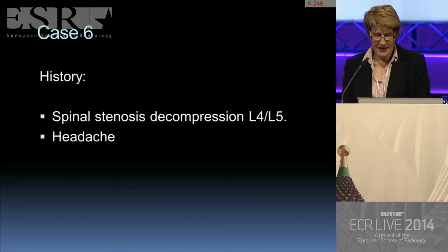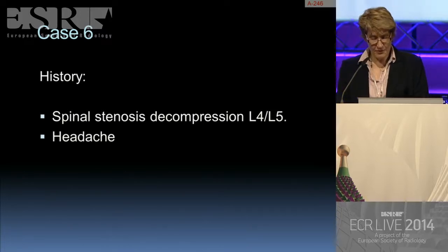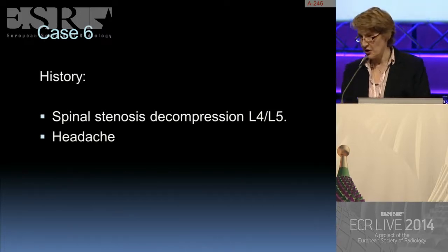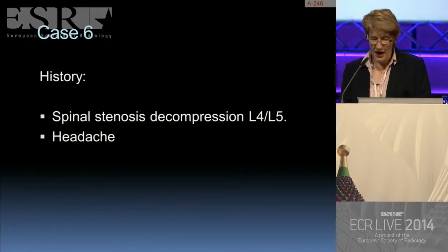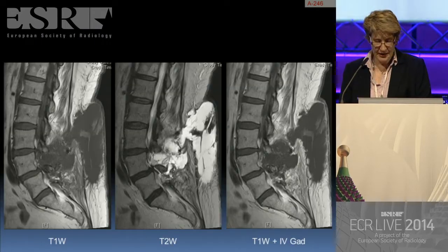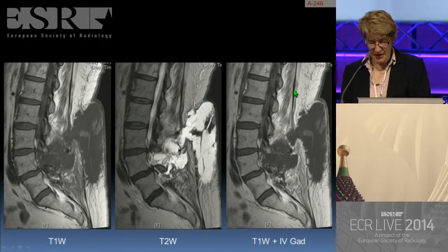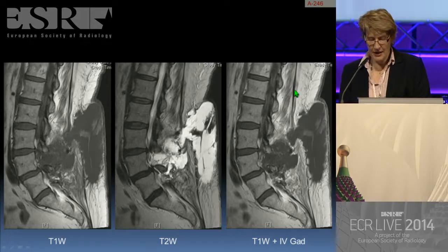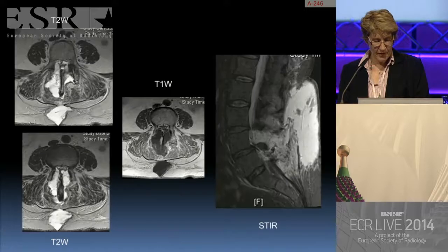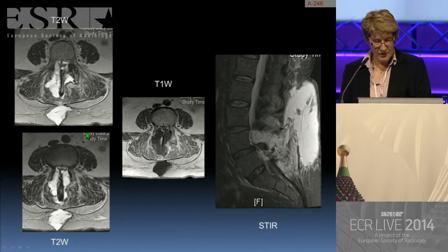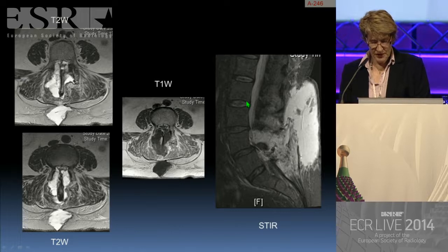Moving on to case 6: a patient who had a spinal stenosis decompression at the level of L4-L5 and went on to complain of headache. Here is the T1-weighted study, the T2-weighted study, a T1-weighted study following intravenous gadolinium, axial images, and a sagittal STIR sequence.